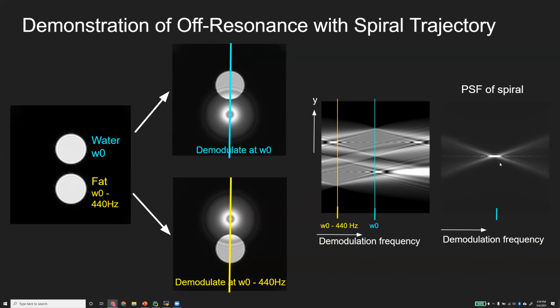In 3D, this is actually a cone pattern. Because this blurring occurs not just along the line where the original point was, but it blurs along Y spatially, that is the reason why you see this blurring on top of the other parts in the image.